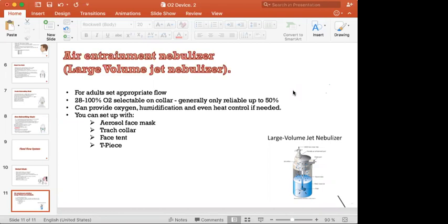Why don't we add a humidifier at this point? Because the patient has the humidification system in his nose, so the patient doesn't need any extra humidification. That dry oxygen is okay for the patient because of the humidification system in the nose.